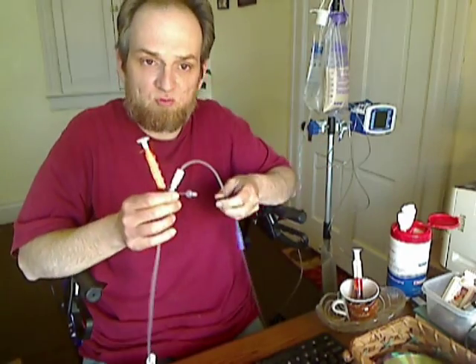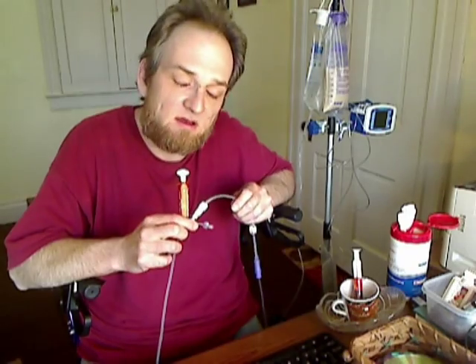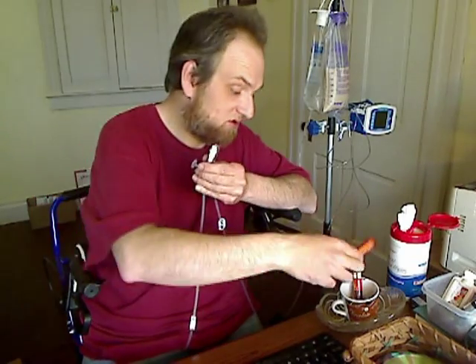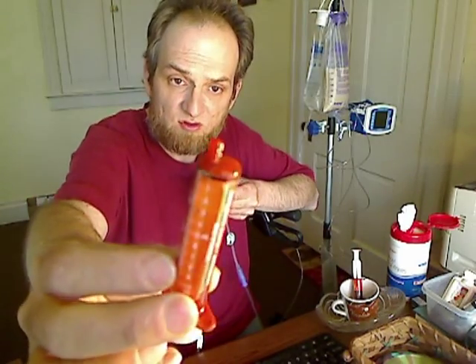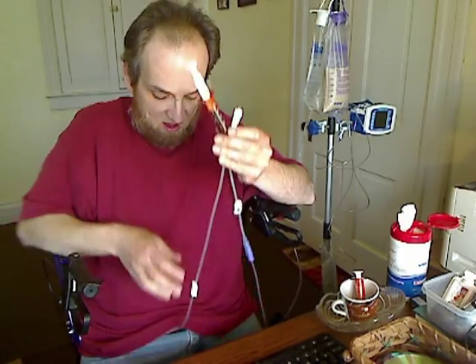And I'm going to flush it about 30 cc's, which is about 10 seconds. Okay, all the medicine is out. I'm going to turn the water off. I'm going to turn the stomach off. I'm going to put the empty medicine syringe back in the cup over here, and I'm going to take my next medicine. I'm going to go ahead and open the stomach, and I'm going to administer my medicine.